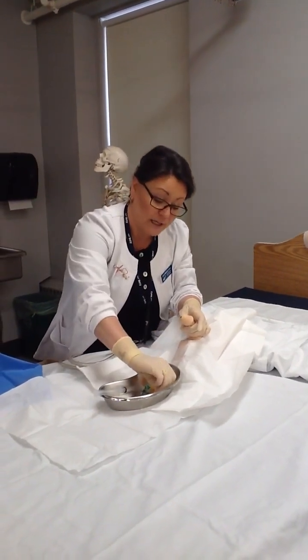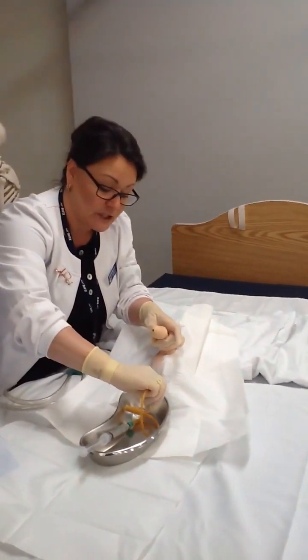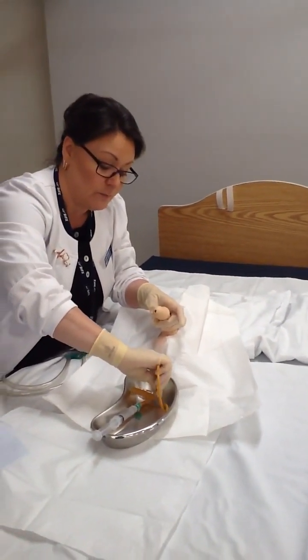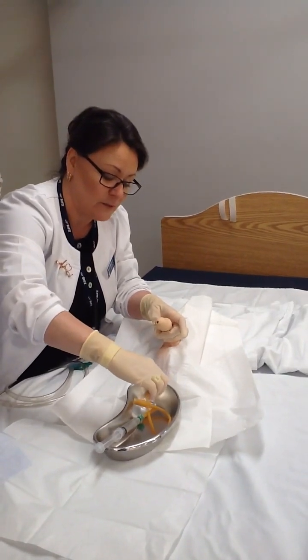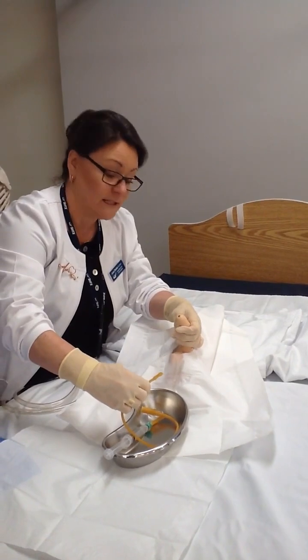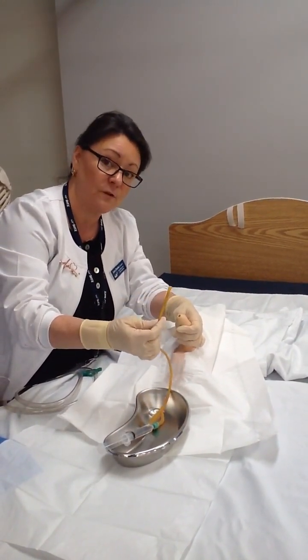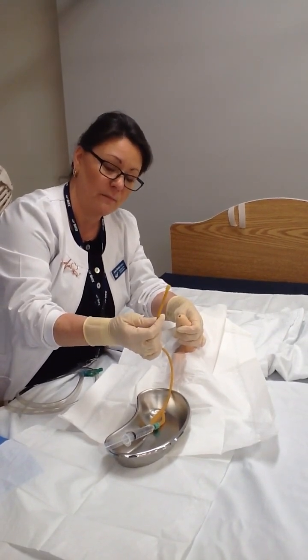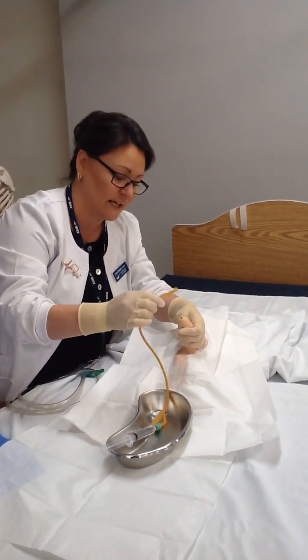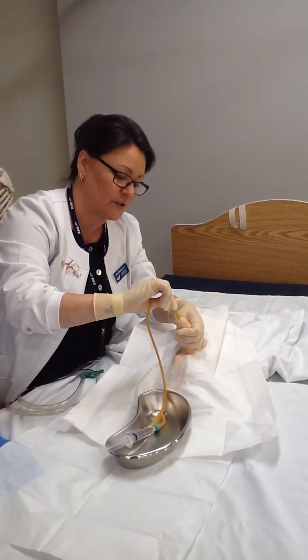So I'm going to pick up my end, and I'm going to tell Jesse to bear down as though he were having a bowel movement. I'm going to point the penis all the way to the ceiling because that really eases the insertion. I'm going to keep my sterile fingers back from the meatus and back from the genitalia. I never want to touch the genitalia. That would contaminate my gloves. And I'm going to just start to insert.